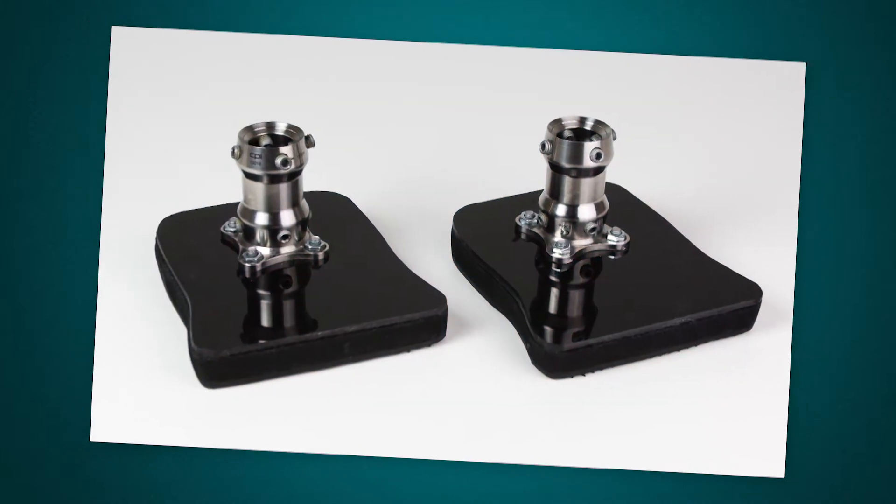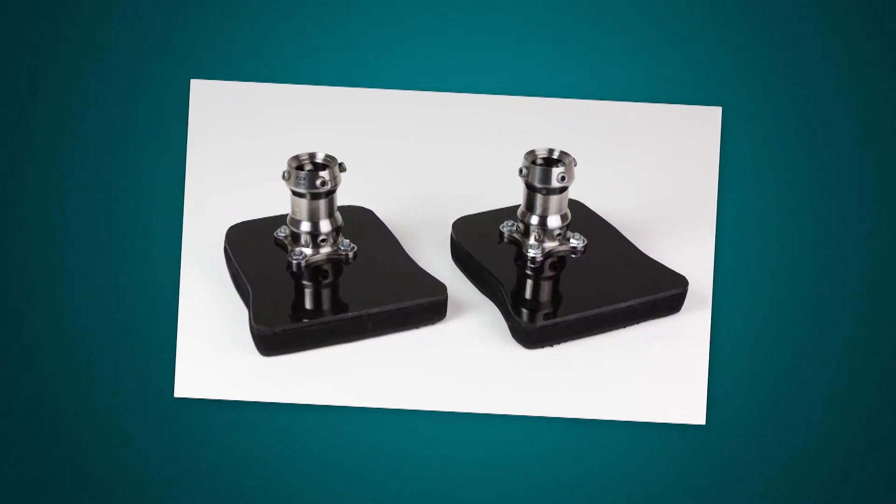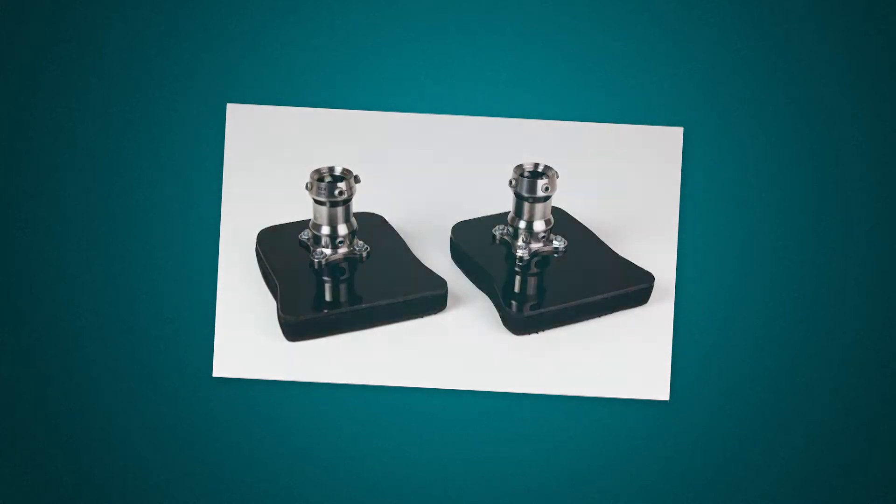Up until now, the options for stubby feet were limited, with most practitioners fabricating their own. The lack of movement and large footprint do not always promote balance or proper walking habits.